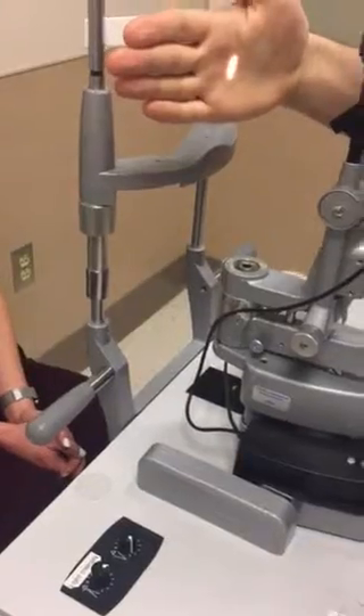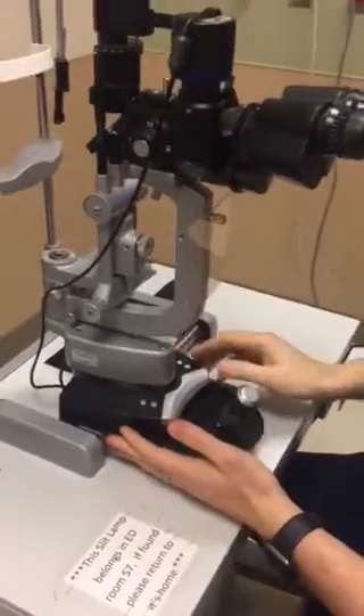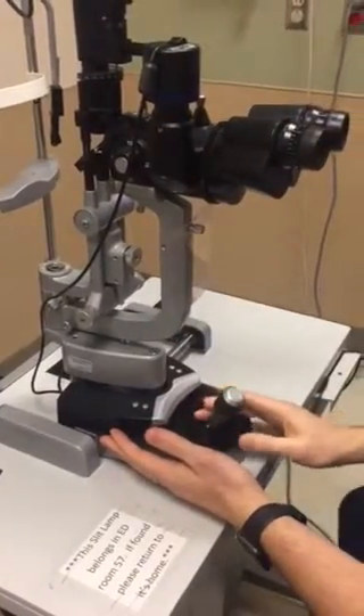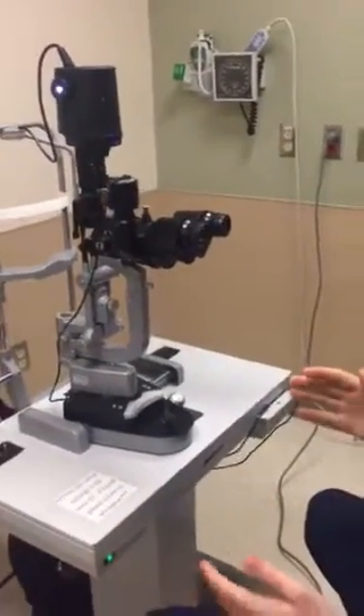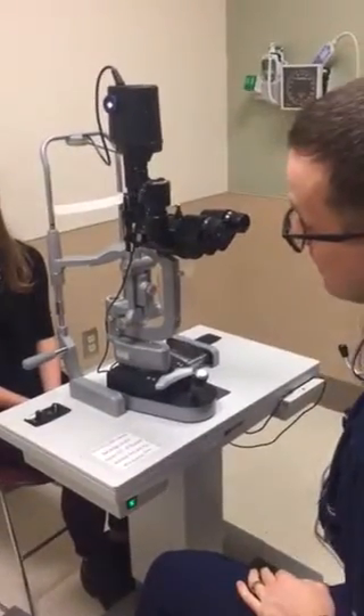Bring the slit lamp all the way back and have the joystick back — that's your starting position. Now that you've made all the necessary adjustments to the slit lamp — appropriate light setting, beam width, length, and illumination control — you're about good to go with the exam.